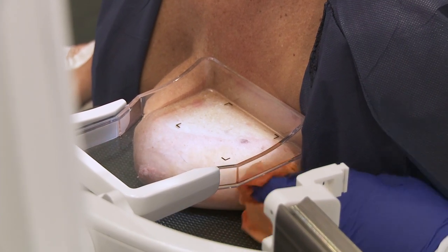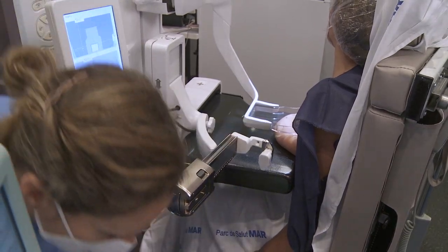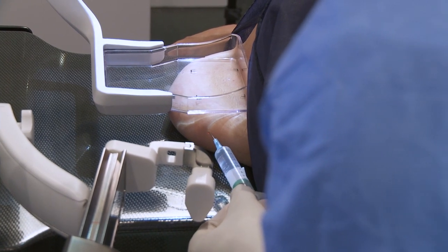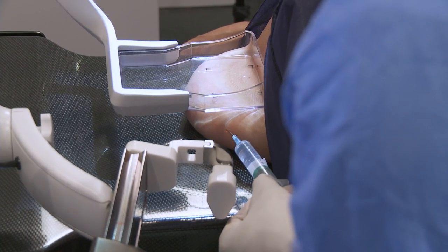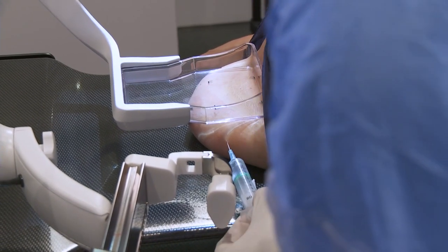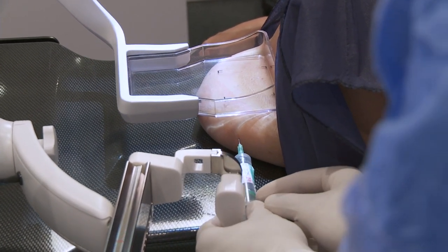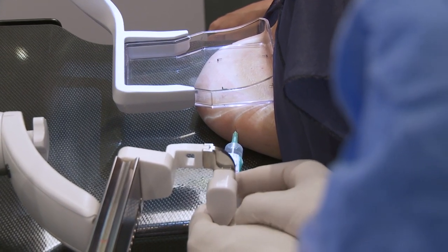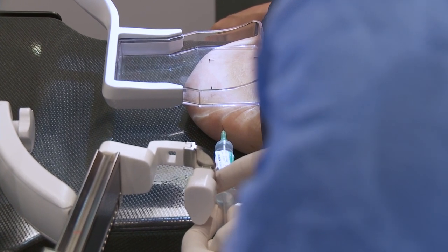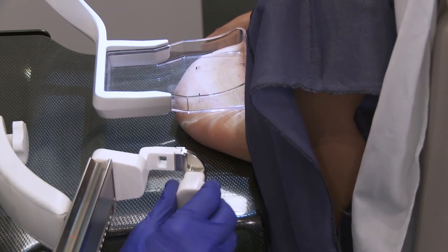Proceed with skin disinfection. Insert the needle guide support. Insert the laser to mark the precise skin incision location. Inject superficial anesthesia, to be followed by deep anesthesia.